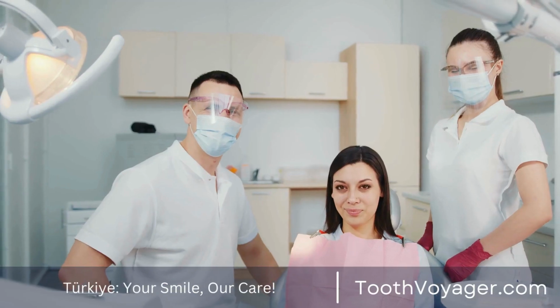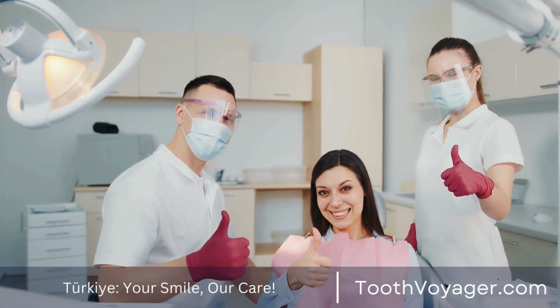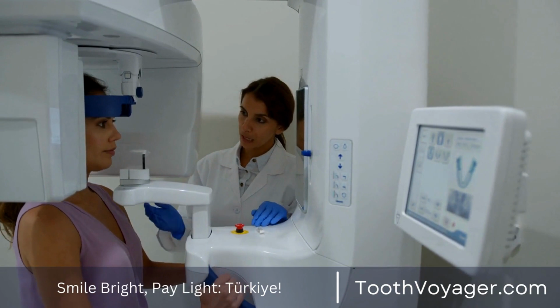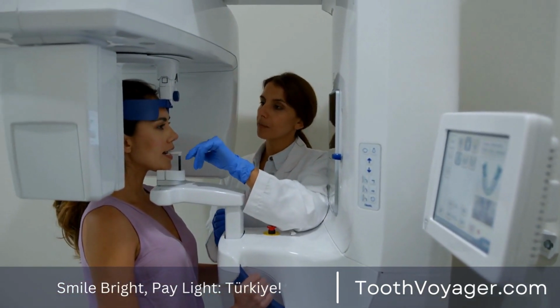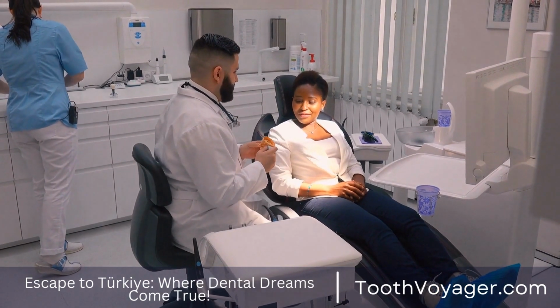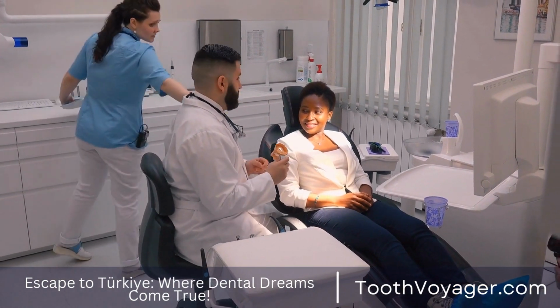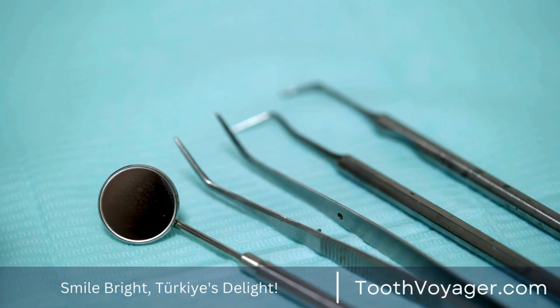They're usually used for situations in which there are natural teeth on opposite sides of the missing tooth. False teeth are connected to crowns, which are then cemented onto natural teeth on both sides of the gap. The cantilever bridge is used for cases when there's only one natural tooth next to the gap where the missing tooth previously was. The false tooth or teeth are fixed to a crown that is fixed to the natural tooth next to the gap.